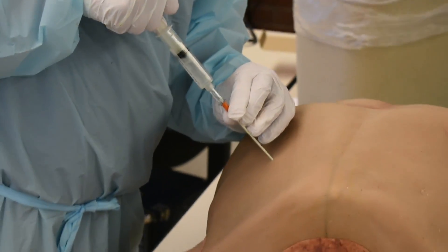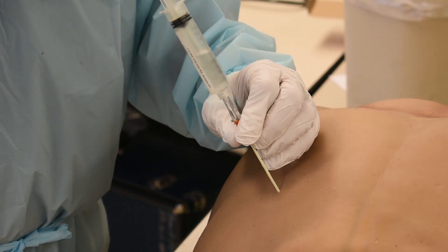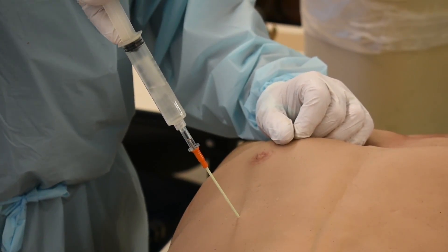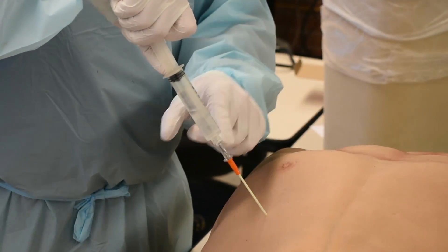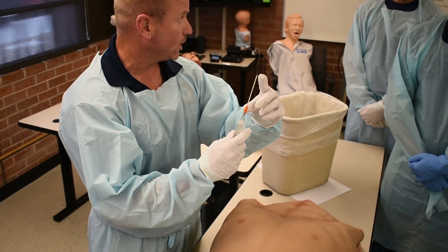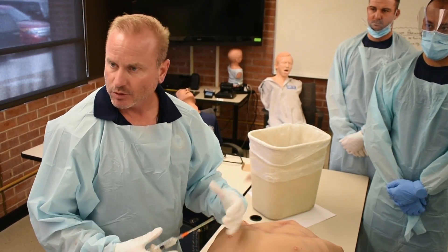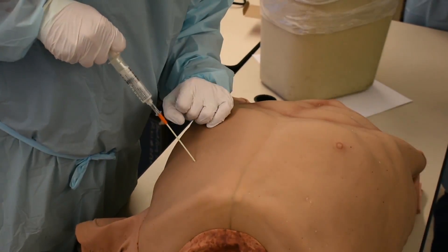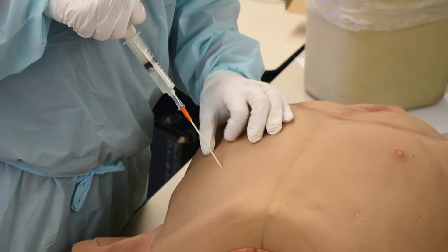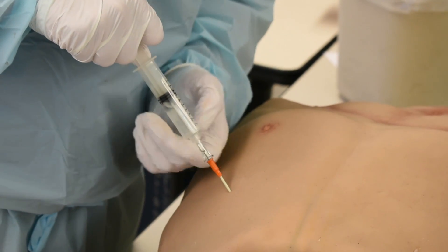If you're not through the chest wall cavity yet, I'm pulling back and not really getting air bubbles. Once I get in there — see how easy that is? In the middle of the night for night ops under NVGs, you could just by tactile stimulation — wow, I pulled that syringe back so easily. I'm in nothing but an air-filled cavity. That's why you stop driving your needle. If your lung happens to start reinflating, you wouldn't want to push this through the lung parenchyma — through the actual lung tissue. If you inadvertently did, you'd know, because the lung is not a hollow cavity; it's filled with millions of alveoli. You won't be able to pull back your syringe because you're not in a hollow space. You may get blood because you may be in a blood vessel, but you won't be able to pull back easily. So think about whether your needle is too far down — maybe you're in lung tissue. We always want to go straight in.